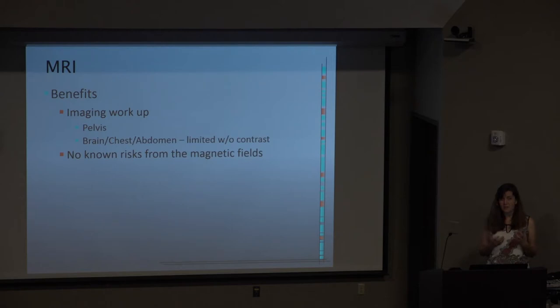And in the last 5 years, there have been a lot of advances to basically make MR faster. So that's basically like CT, and it freezes motion. The issue with MRI is the motion. A lot of the images look blurry because it can't go as fast as a CT, and so you see the motion. That's kind of been resolved in the last 5 years, but that means you would have had to purchase these machines in the last 5 years, and they're very expensive, so it takes time for the community and the smaller places to get this. So that's just my caveat to MRI.